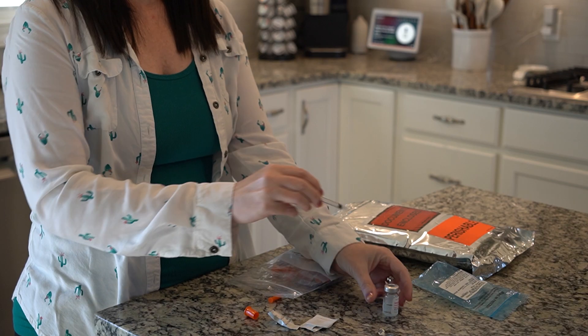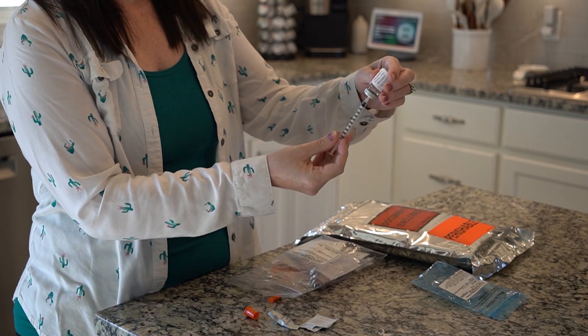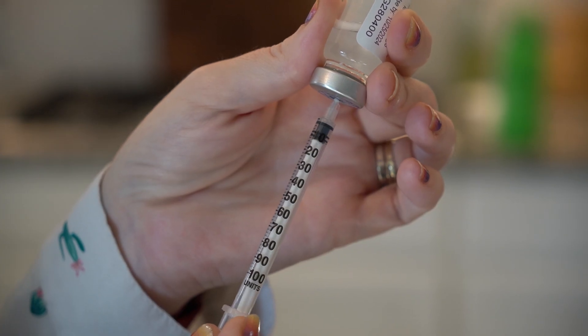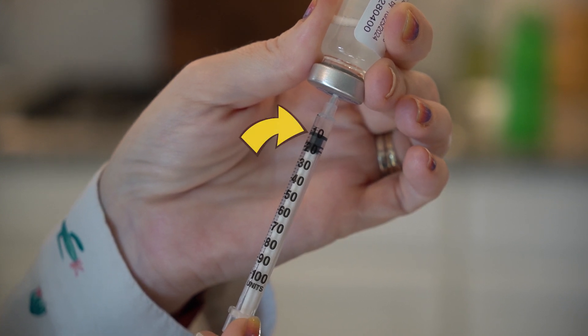Now insert the needle into the vial. Inject the air. Invert the vial and withdraw the prescribed amount of medication. For example, if your dose is 10 units, draw back the medication until the top of the black stopper is at the 10 unit mark. Be sure to keep the needle tip below the level of the solution while you are withdrawing the medication so you are not drawing back air.